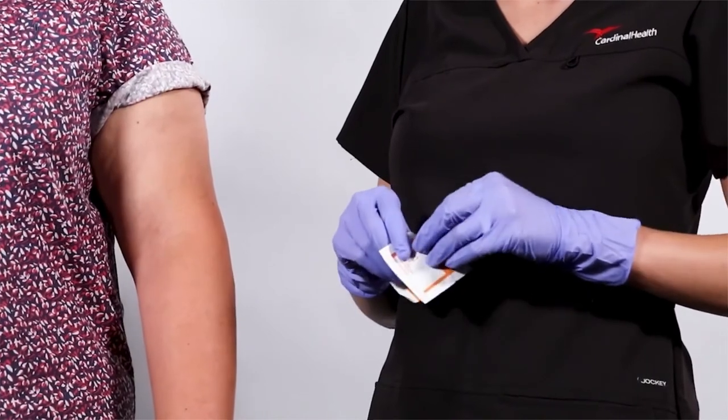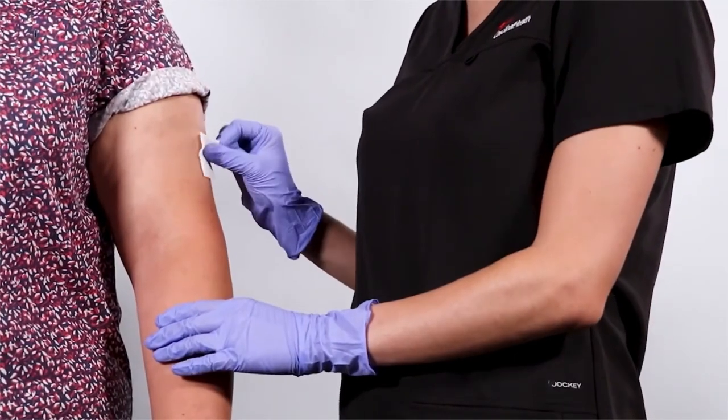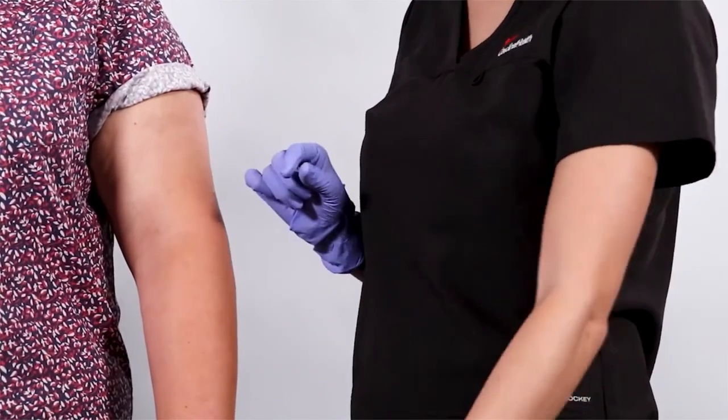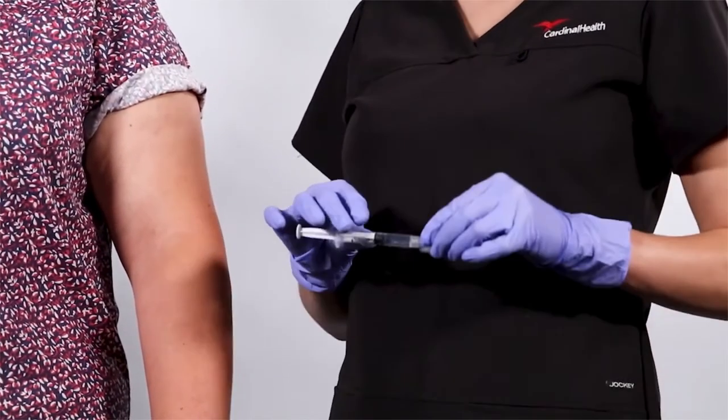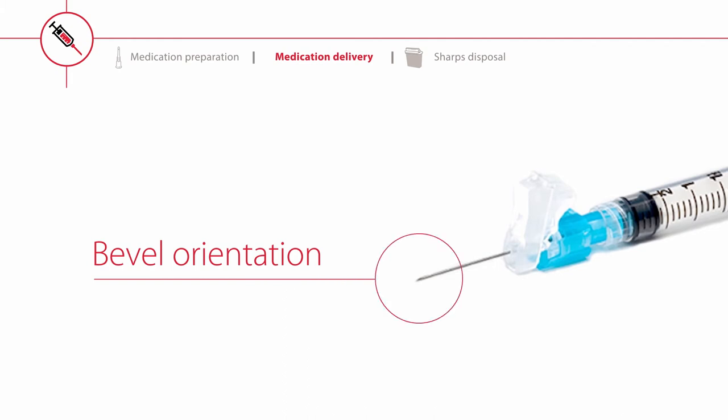Prepare the injection site and remove the Magellan safety needle's protective sheath. For your convenience, the Magellan safety hypodermic needle has been developed with bevel orientation so that if the safety shield is up, the needle bevel is facing up.